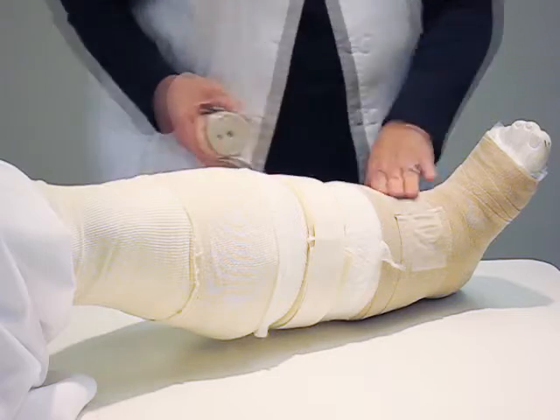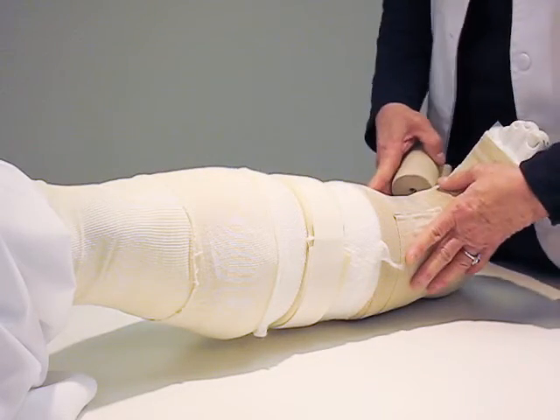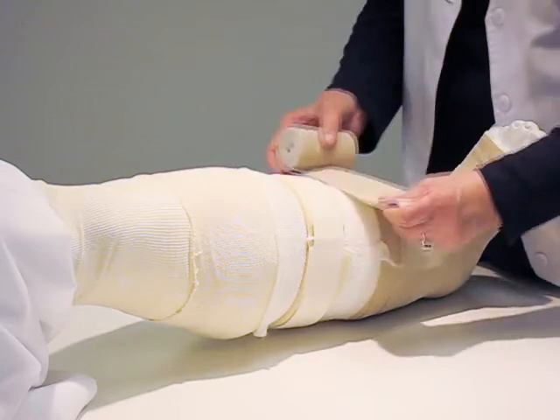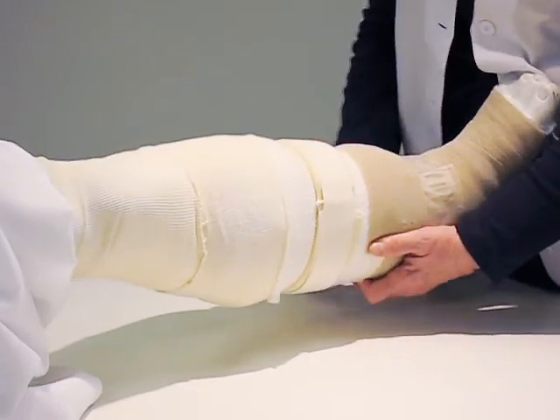The uniform surface will allow the wrap to work properly and encourage the flow of lymph fluid out of the affected limb. Without the beneficial support provided by both forms of compression, lymphedema physical therapy treatment would not be possible.